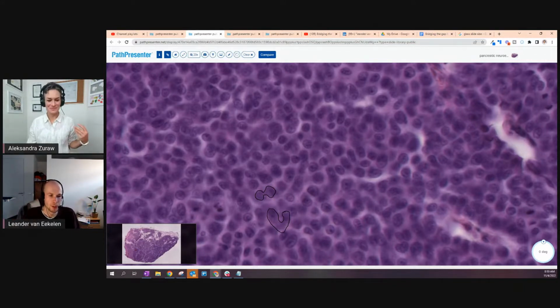Instance segmentation. Yes. In this case, instance is already an intuitive word, or it helps you to understand the concept. Instance, as in it's a discrete object that you're segmenting. If you build an instance segmentation model, you have decided that you see value in also discriminating between discrete objects.